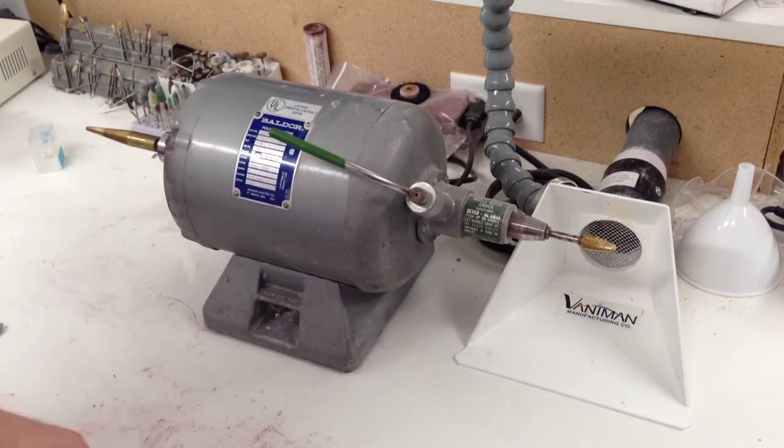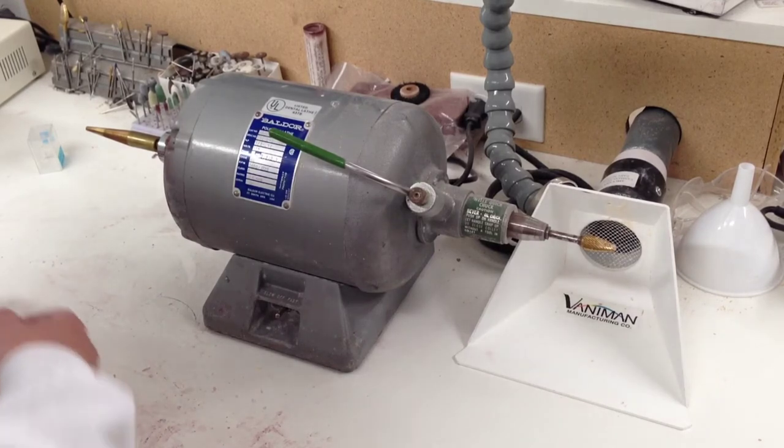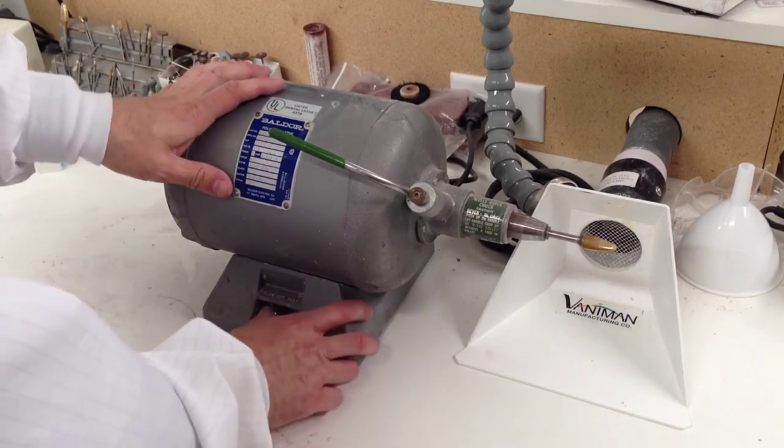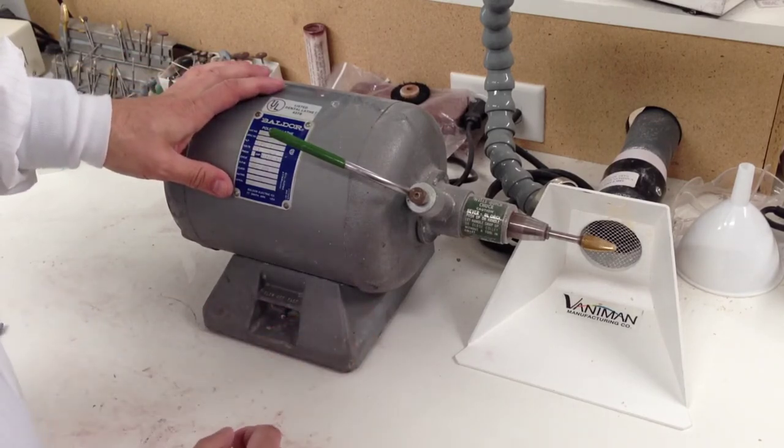The purpose of the quick chuck is to allow you to work faster without having to stop the lathe when changing burrs. You have your slow and fast settings.